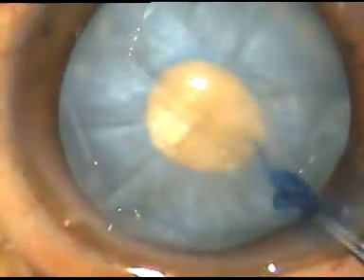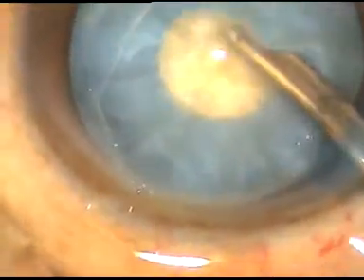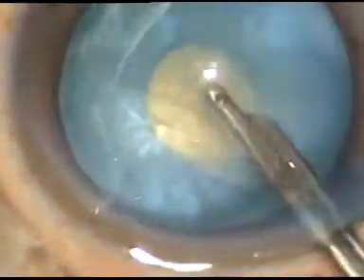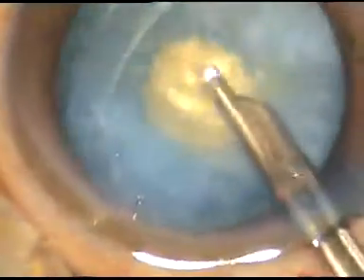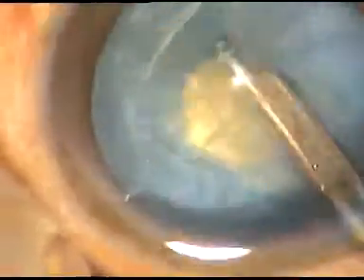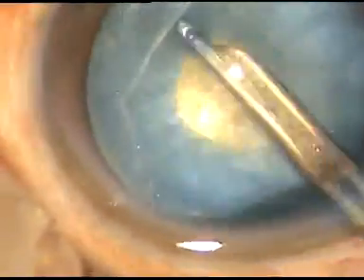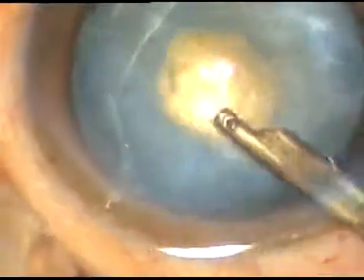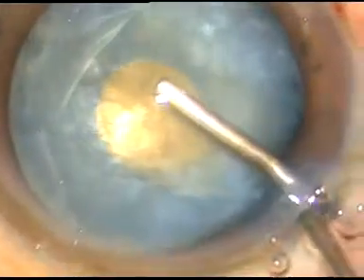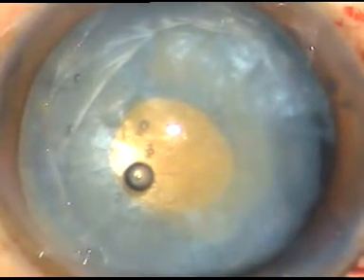The anterior chamber is sufficiently deep to make this rhexis. And on-go. Now I go with a Simcoe cannula and aspirate some cortical lens matter to decrease the intralenticular pressure. You may use bimanual irrigation-aspiration if you want. To decrease the intralenticular pressure is the objective. And after this is achieved — once you decrease the intralenticular pressure — the capsule shrinks.